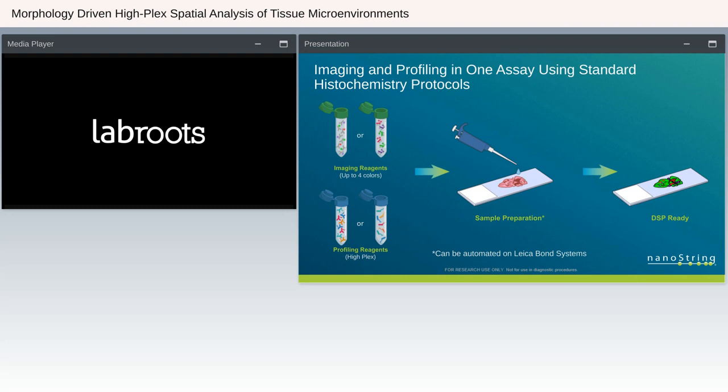expression data from. And then, as you've seen in that previous example, we also label up that section with some fluorescently labeled probes for doing the region of interest selection and for visualizing our tissue on the system. The system itself has 4 fluorescent channels built into it. So we'll label up that section with up to 4 fluorescently labeled probes for visualization. And all of that gets cocktailed together on that section, and then that section goes on to the GeoMx system and is ready for profiling.